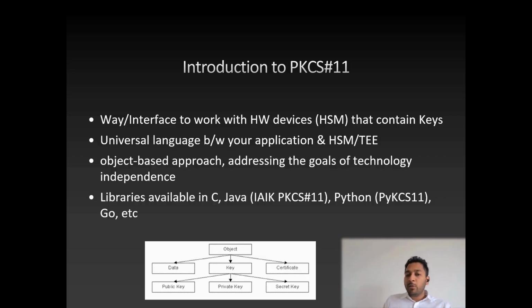So it uses an object-based approach. As you can see, all this data that you store in these HSMs are just objects in front of PKCS11's eyes. That's how it achieves the technology independence. So there are a lot of objects: key objects, certificate objects, data objects. These are general objects; it could be any data, any blob data, or secret key objects.